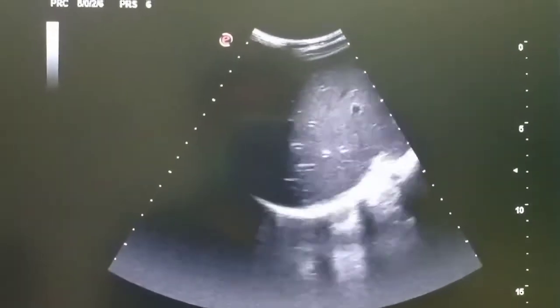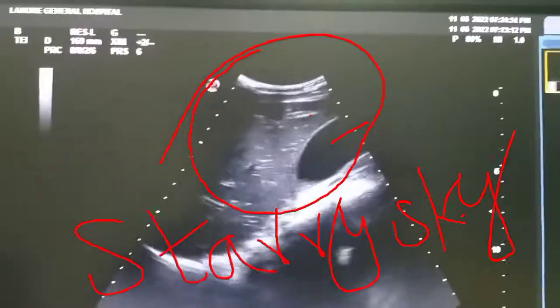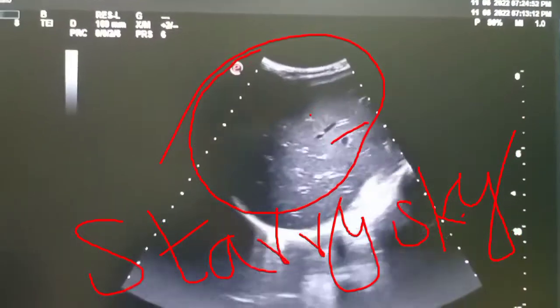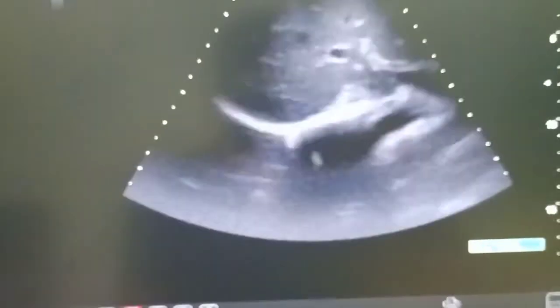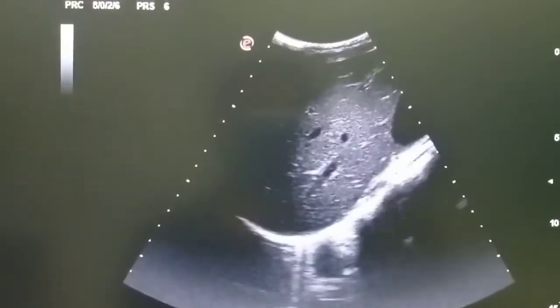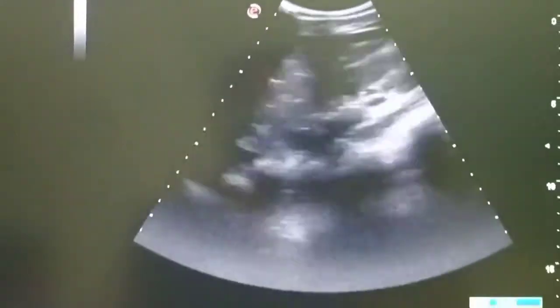You can see I am scanning the hepatic region. You can see raised periportal echogenicity of the liver, and it is giving a characteristic starry sky appearance of the liver. This condition occurs in acute hepatitis A and E. In this video you can again see that there is increased periportal echogenicity of the liver.